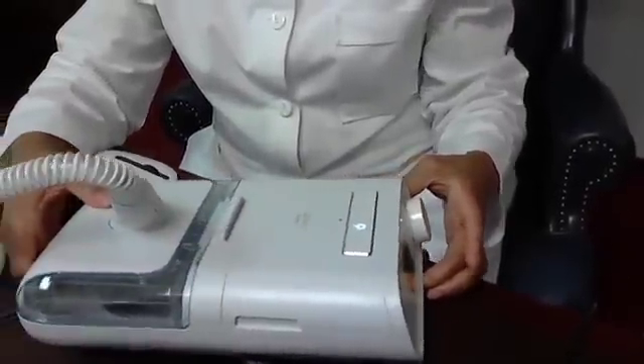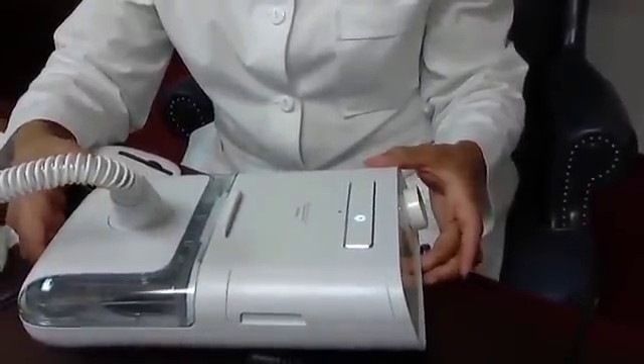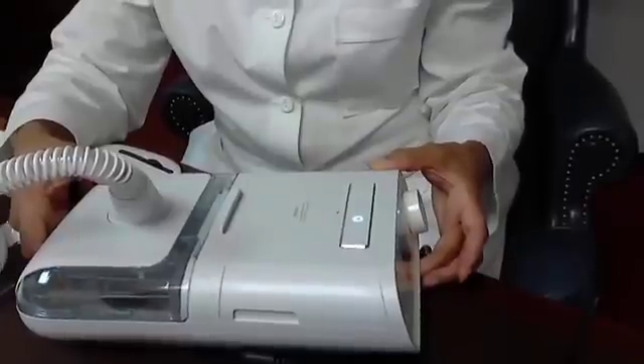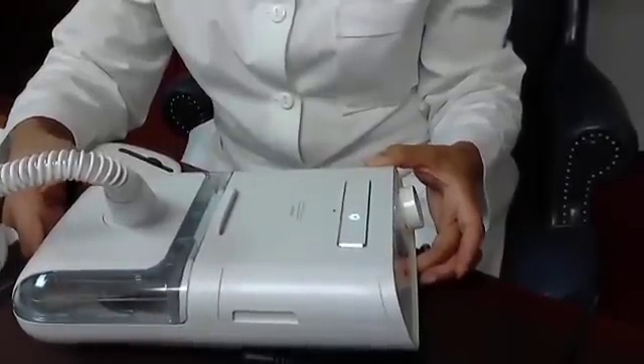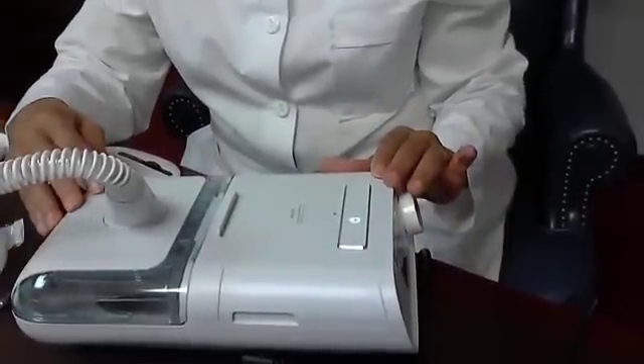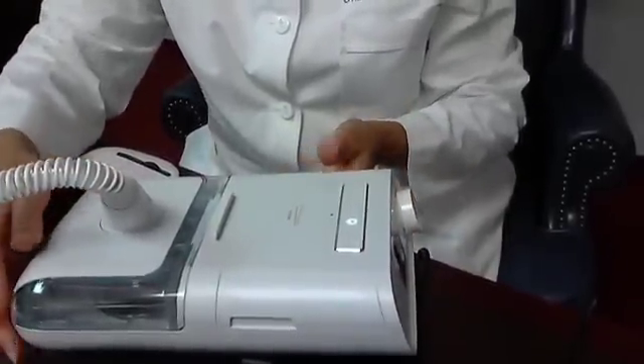This is a DreamStation APAP machine, or Auto Positive Airway Pressure Machine, and a humidifier. This part is the machine and this part is the humidifier. So let's start with the machine.